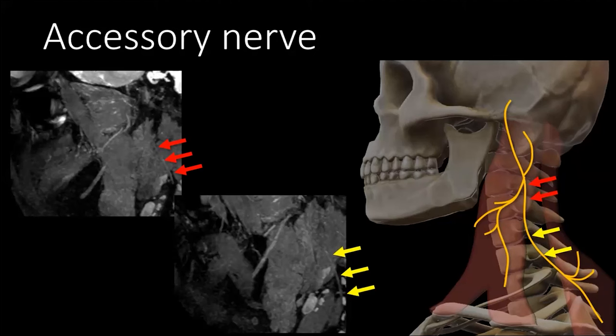So if we can better tell the surgeon ahead of time whether or not a sacrifice of the accessory nerve is necessary, is there involvement of the accessory nerve by the lymphadenopathy, that might help them, if there's no involvement, steer very clear away from that region and possibly avoid further injury in that region.